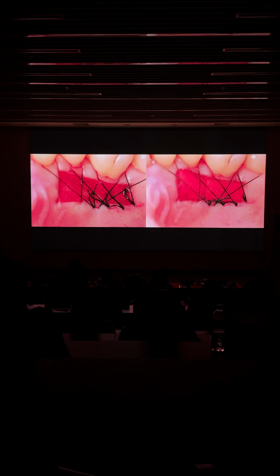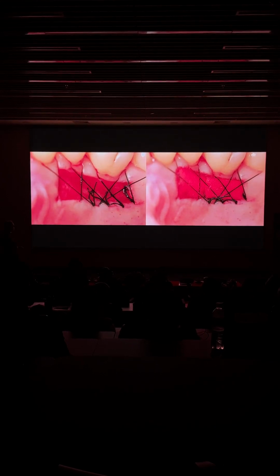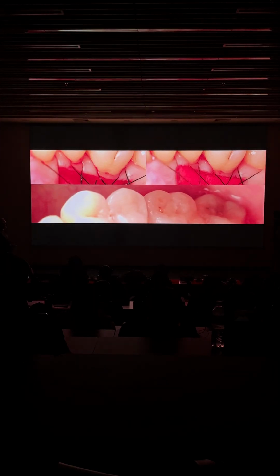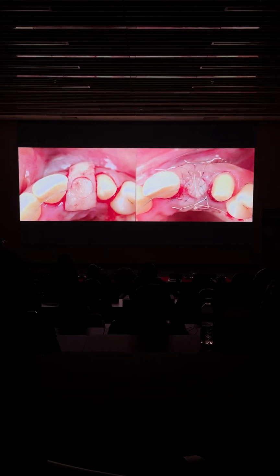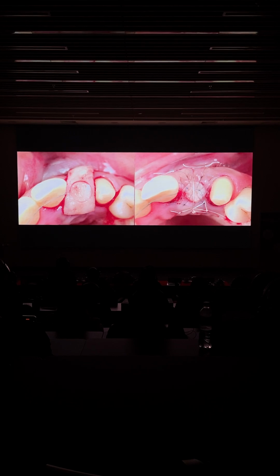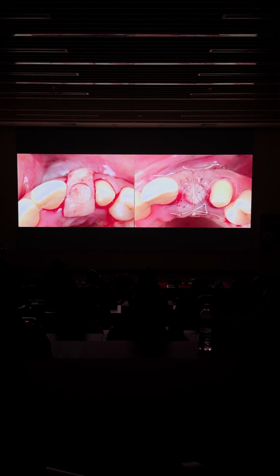Then I suture, then I place my collagen sponges, and then what I do is I place my cyanoacrylate on top and remove it within 15 days. Okay? The idea is this extension of 1 millimeter go below the papillas, so you will maintain in a better way the soft tissue.